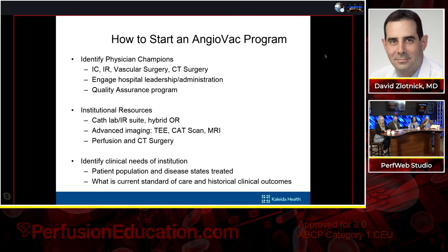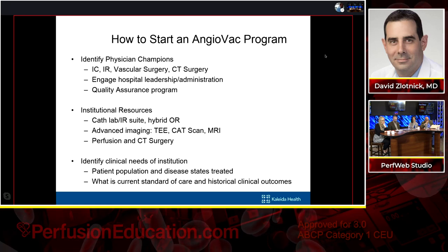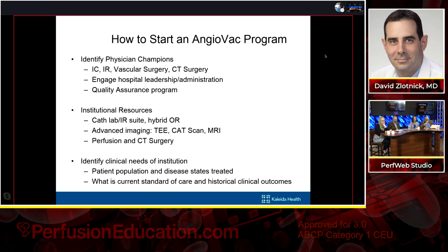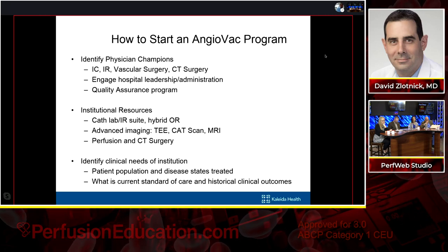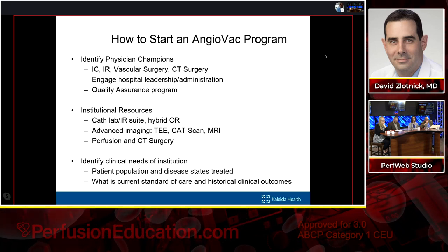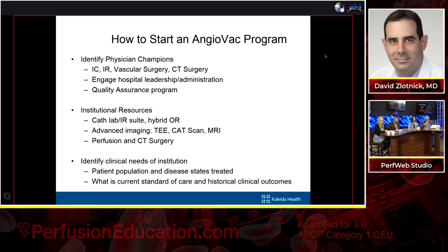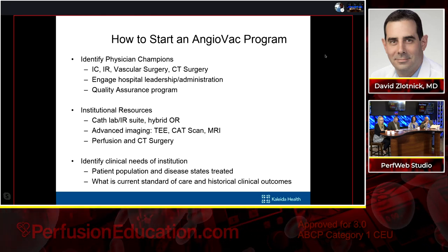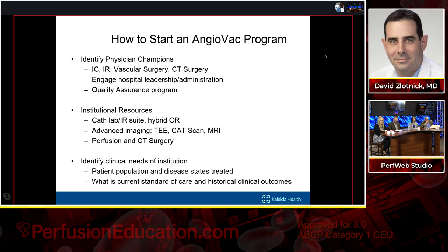How to start an AngioVac program is a question that I get asked a lot by my colleagues around the country. I think the first thing we need to do is identify champions in the institution, whether it be an interventional cardiologist, an interventional radiologist, vascular surgeon, CT surgeon, or perfusionist, somebody who's going to champion this technology. Obviously, we need to engage our hospital leadership and administration because this is not a light expense. And anytime we start programs, we need to have quality assurance monitoring how the program is going, what we're doing, making sure we're doing the right things for our patients.